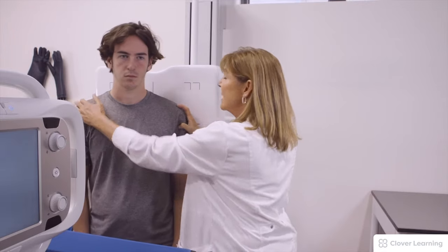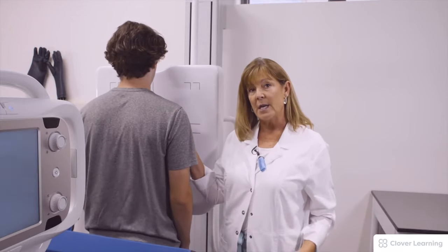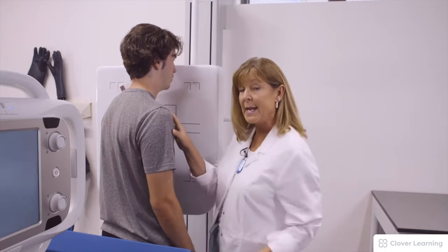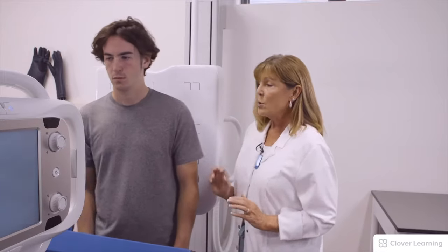Today I'm going to demonstrate a posterior injury — taking a radiograph AP above the diaphragm and then one below the diaphragm. For AP rotation, if the injury is on the left we roll the patient keeping the affected side to the IR, so he would be in LPO. If the injury is in front and on the right, you would pull away to demonstrate the right ribs.